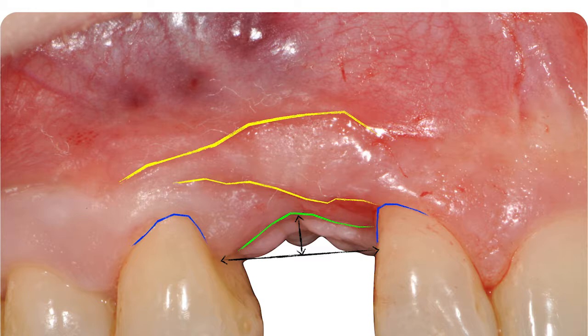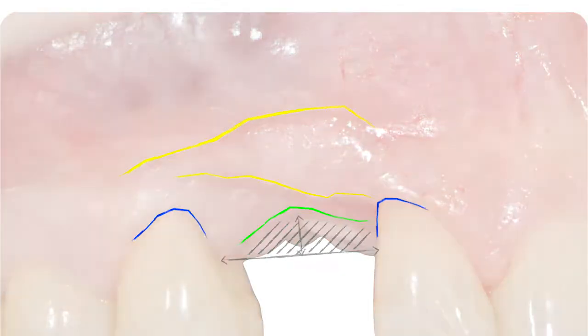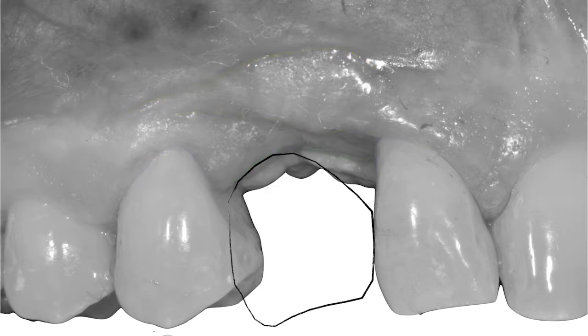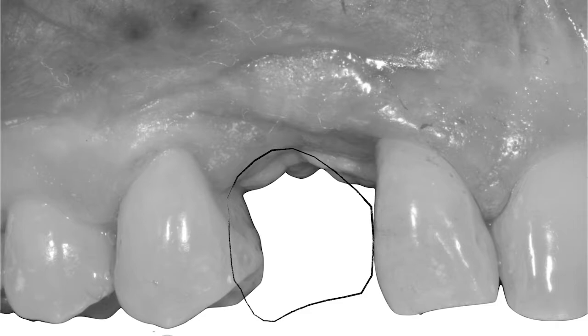So my initial diagnosis was based also on the periodontal assessment of this patient. So number 12 doesn't have a good prognosis, and it's going to be extracted after eventually guided bone regeneration. So if I try to visualize what is going to be my final aesthetic result, and I compare already the emergence profile, I need to have in mind before raising the flap, we need really to know where we are going.